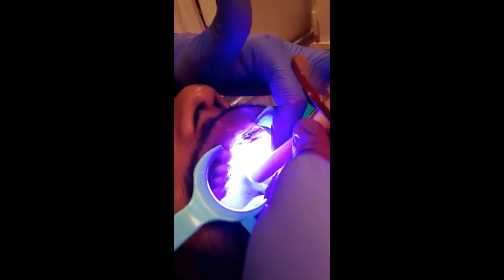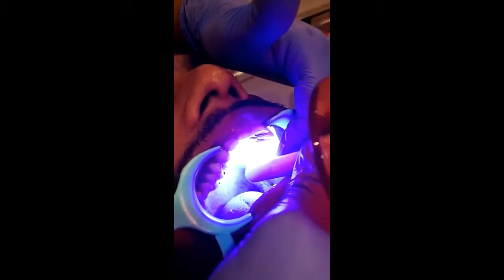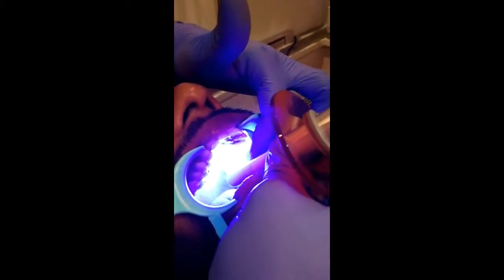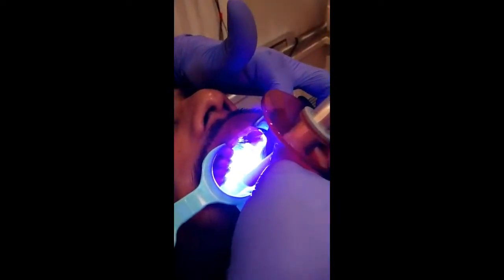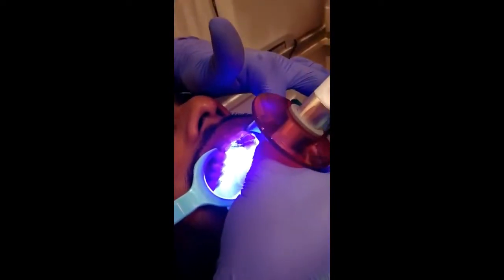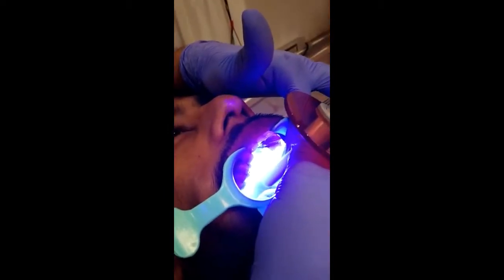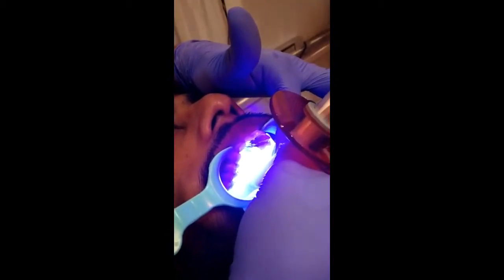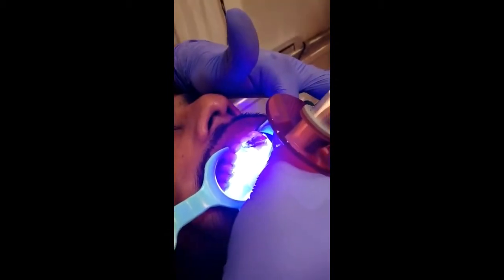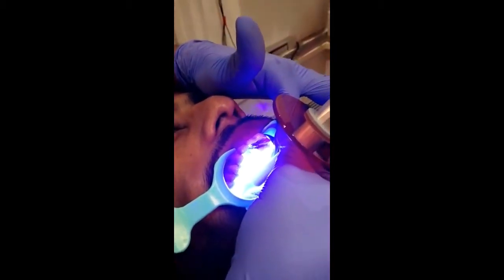As you can see, because it's an indirect bonding technique, there are a lot of advantages that we can gain out of this technique. First thing being, we are doing the bonding in one step for a number of brackets together. So individual bracket positioning and bonding of individual brackets, which generally takes a longer time, is drastically reduced, so we reduce the chair side time. This technique can also be implemented in cases of labial bonding, where we are bonding the brackets on the front side of the teeth.